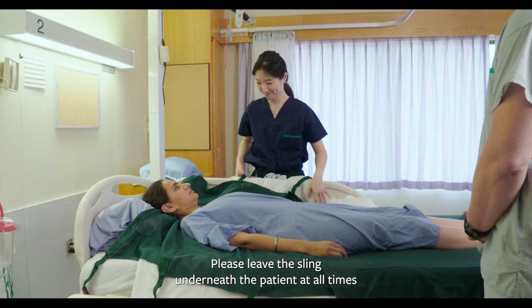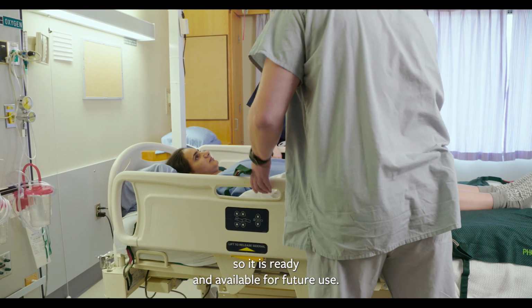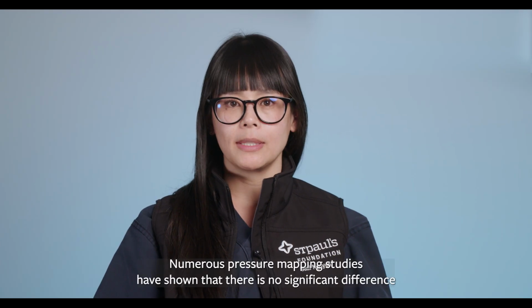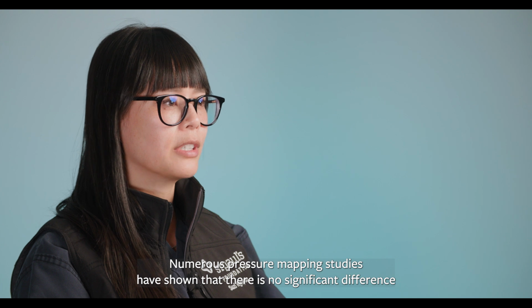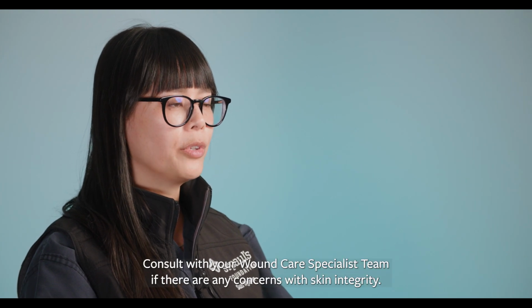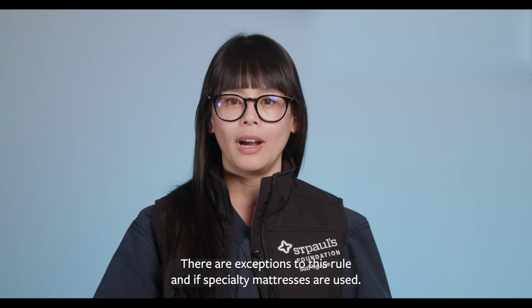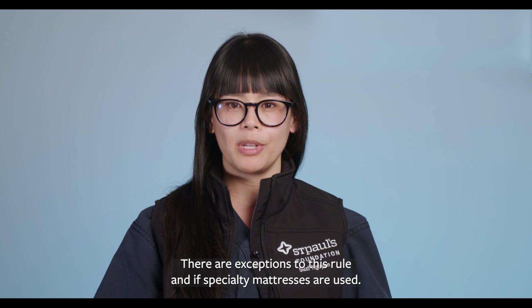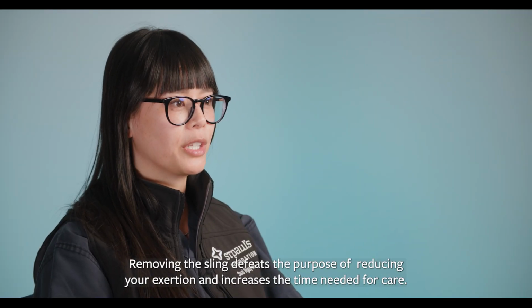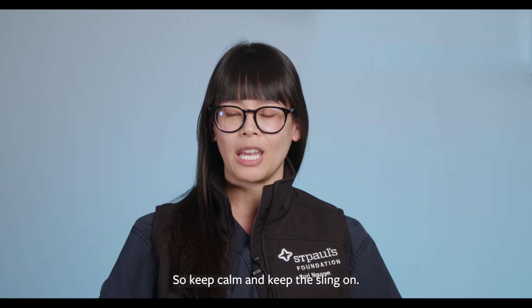Please leave the sling underneath the patient at all times so it is ready and available for future use. Numerous pressure mapping studies have shown that there is no significant difference whether the sling is left on or taken off. Consult with your wound care specialist team if there are any concerns with skin integrity. There are exceptions to this rule if specialty mattresses are used. Removing the sling defeats the purpose of reducing your exertion and increases the time needed for care, so keep calm and keep the sling on.